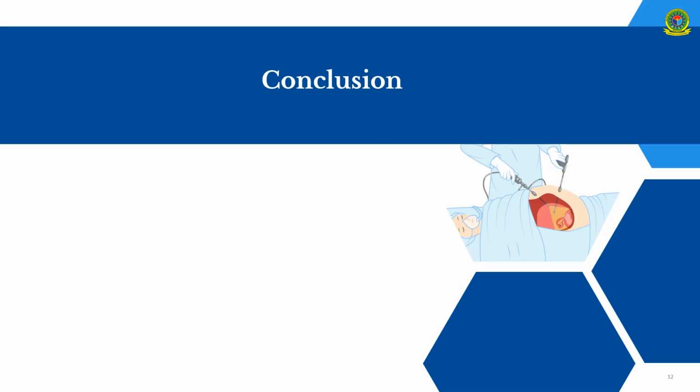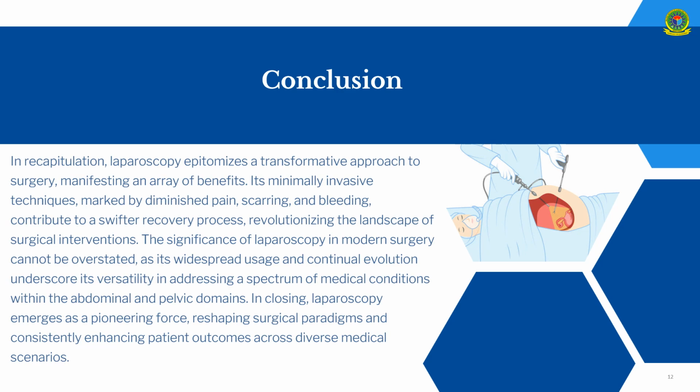We have come to the conclusion part. Here we will talk about all the things that we have covered before. In recapitulation, laparoscopy epitomizes a transformative approach to surgery, manifesting an array of benefits. Its minimally invasive techniques, marked by diminished pain, scarring, and bleeding, contribute to a swifter recovery process, because we make small incisions here, so the recovery process is much faster than others. And it revolutionizes the landscape of surgical interventions.